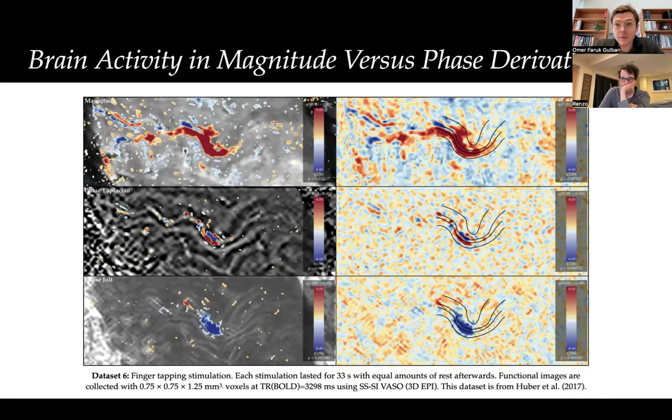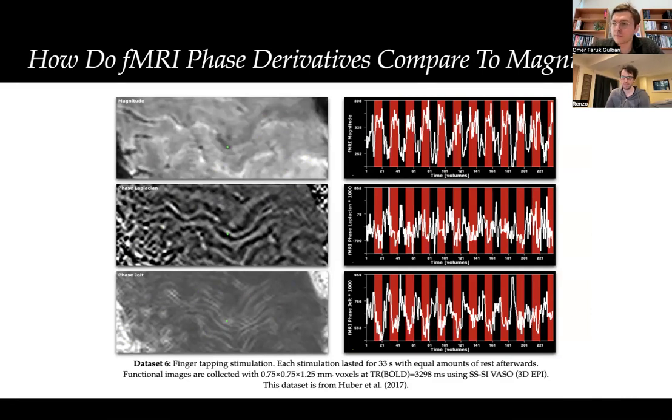Faruk, can I ask something really quick? Maybe you're going to get to this in the next slide, but I'm curious if this relates to the fact that the Laplacian is over a larger area, and therefore you're seeing differences in essentially the segmentation. Like the difference between the gray matter voxel or the CSF voxel that you choose and the tissues next to it are getting closer together or farther apart. Yeah, I will come to this actually. Just to clarify, there is no segmentation here.